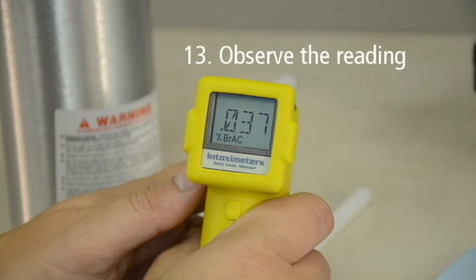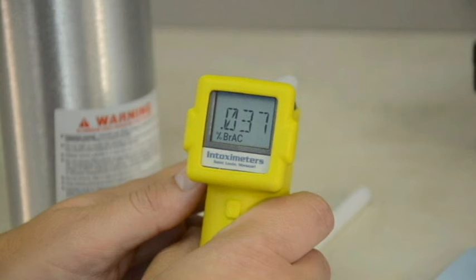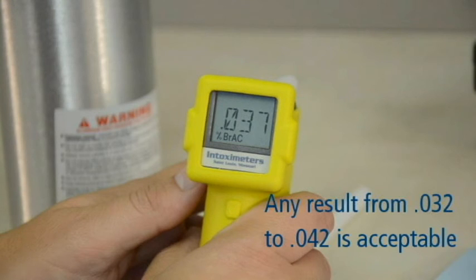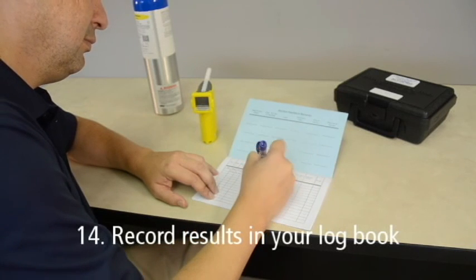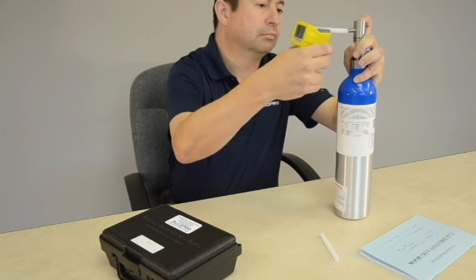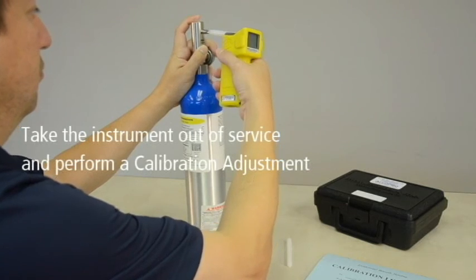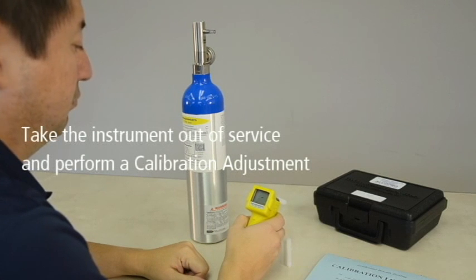Remove the Alkosensor FST from the regulator and observe the reading. Remember, the results of your accuracy check must be within plus or minus .005 of the expected known value. From our earlier example of an expected value of .037, any result from .032 to .042 is acceptable. Record the accuracy check result in your logbook. If the result falls outside of the acceptable tolerance range, you must take the instrument out of service and perform a calibration adjustment to bring the instrument back into an acceptable tolerance range.